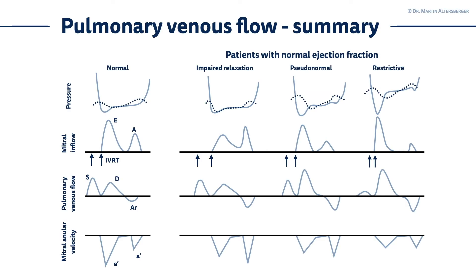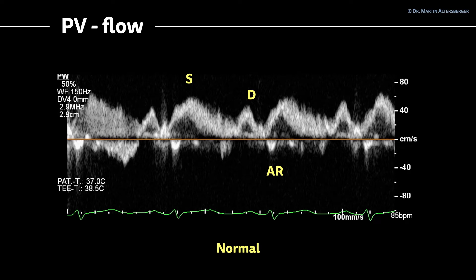Hello, it's Dr. Macho for heart and lungs focused ultrasound. In the next image, I want to show you a pulmonary venous flow signal. You have the systolic flow, denoted with S, the diastolic flow, denoted with D, and the AR time. This is a normal situation.